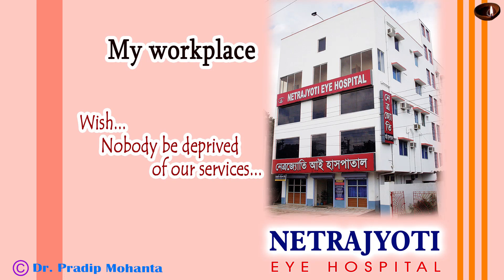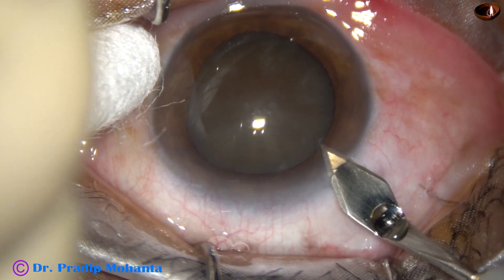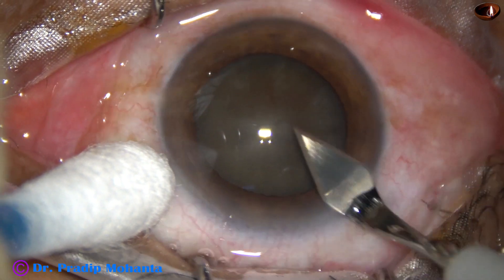Friends, welcome to my workplace at Ranakhart, West Bengal, India. This is a hard cataract; nuclear sclerosis in this case is grade 5 or grade 5 plus.